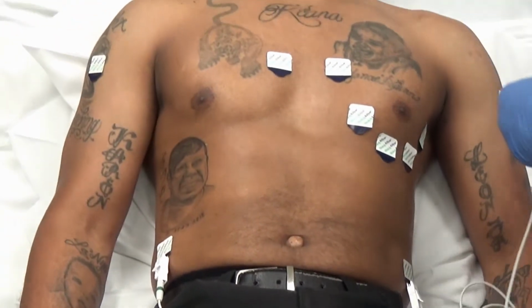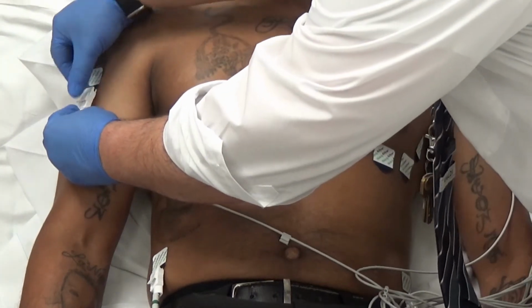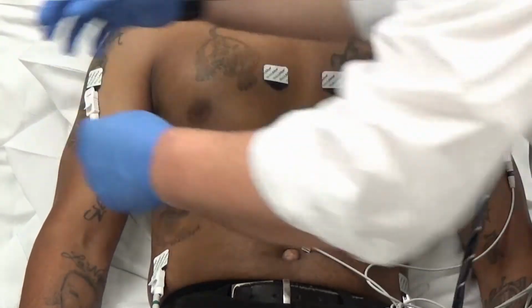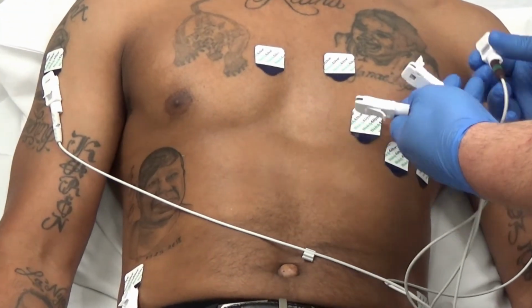Okay, so then your left arm, your right arm. So those are all your limb leads, and then these will be your chest leads.